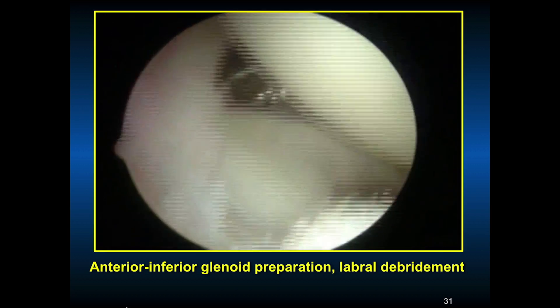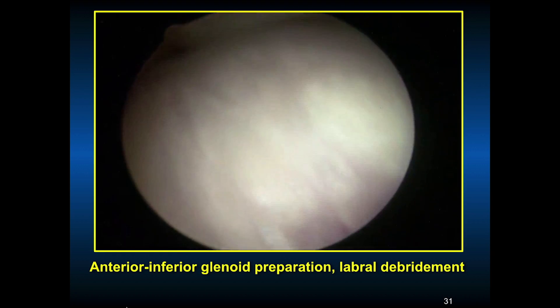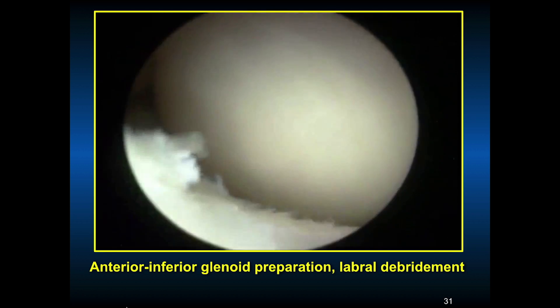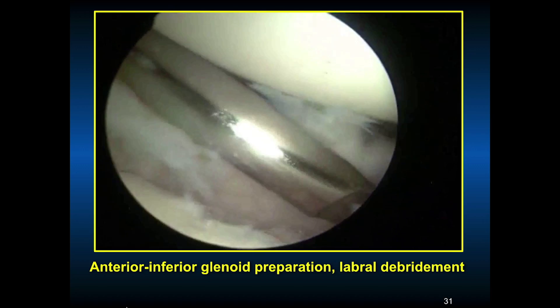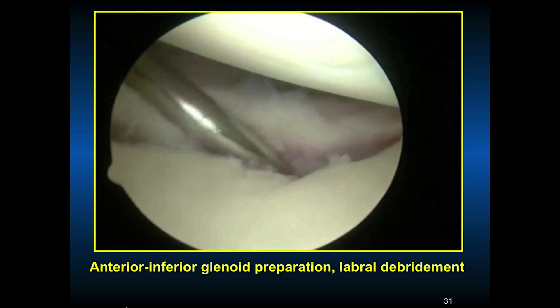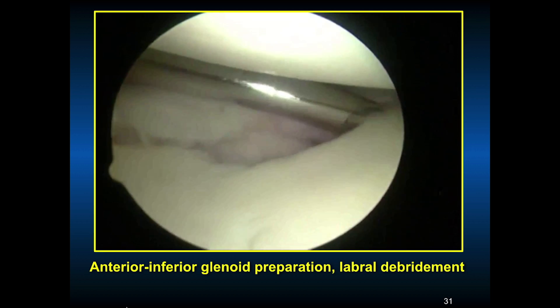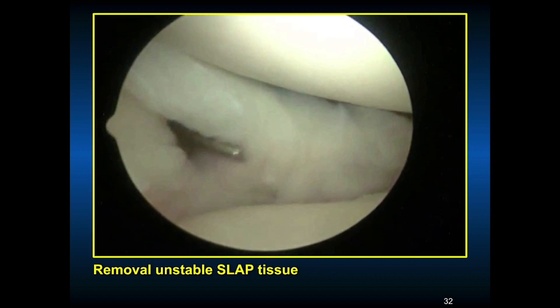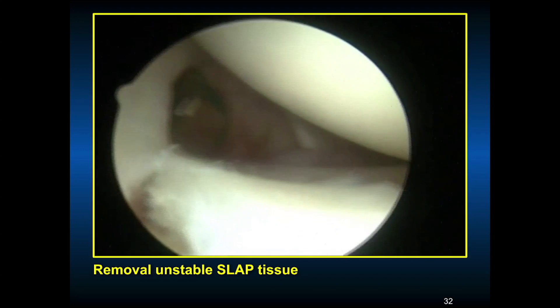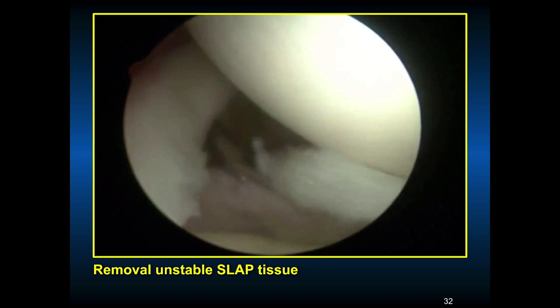We can see the biceps a little bit better and there's still a chunk of that unstable bucket handle tear of the labrum to remove. There's his Hill-Sachs lesion, which is consistent with his anterior inferior instability. Glenoid preparation is very important to successful anterior reconstruction of the shoulder. This shows removing the remainder of that unstable SLAP tissue — you can transect it with arthroscopic scissors anteriorly. Fortunately, most SLAP tears are not a bucket handle or type 4 that have to be removed; usually we can repair them.